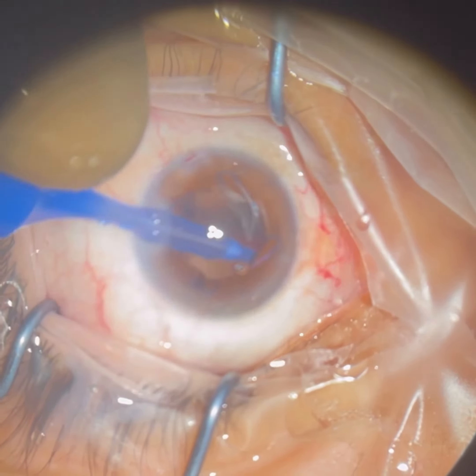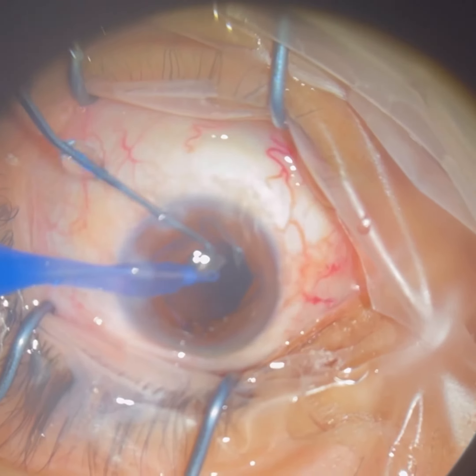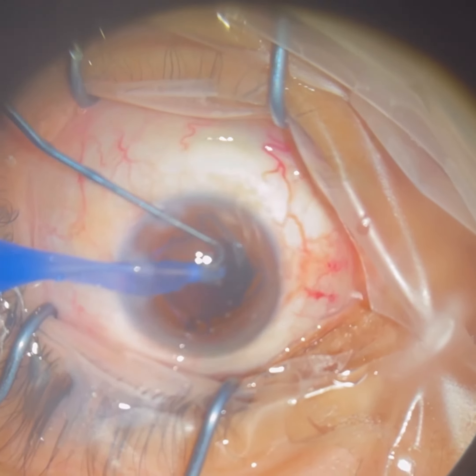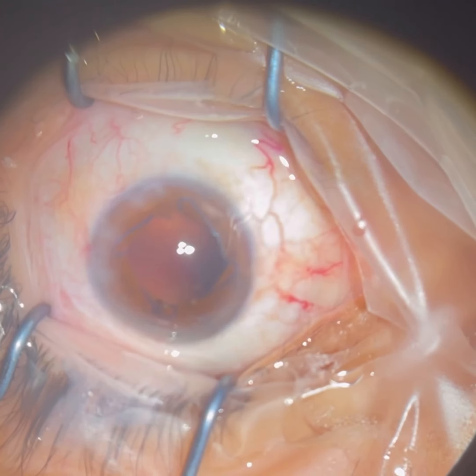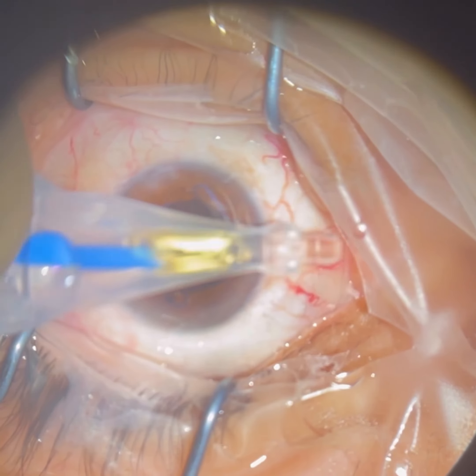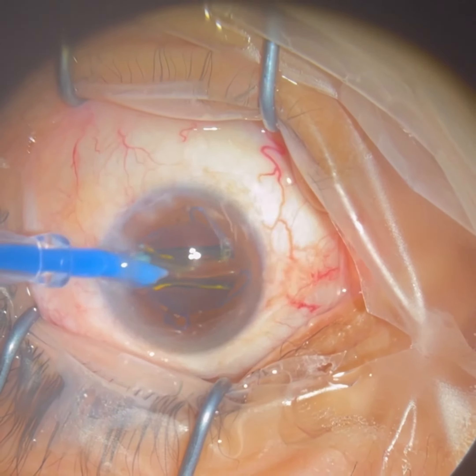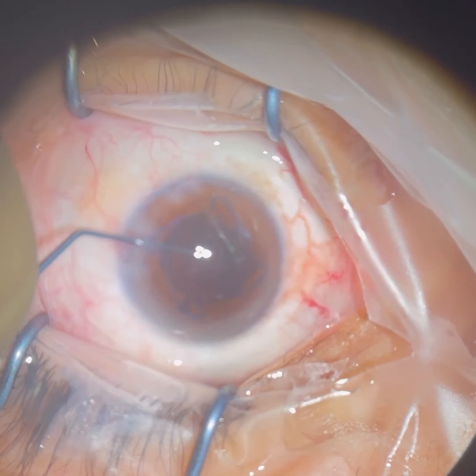Once all the cataract has been removed, the next step will be to take some of our preoperative measurements, which we got in clinic before the surgery to choose the lens power that will correctly correct the patient's vision so that they see far at distance as clearly as possible.